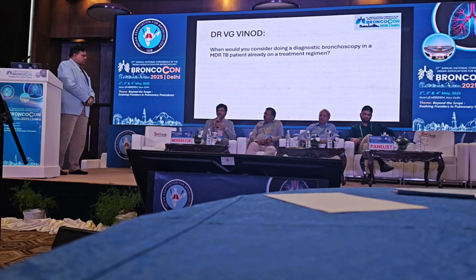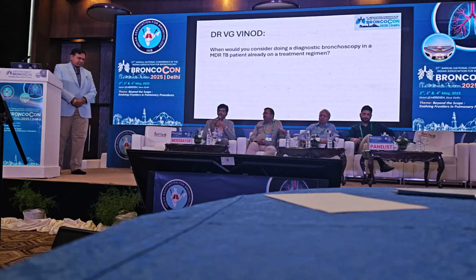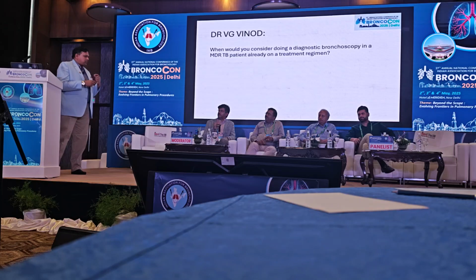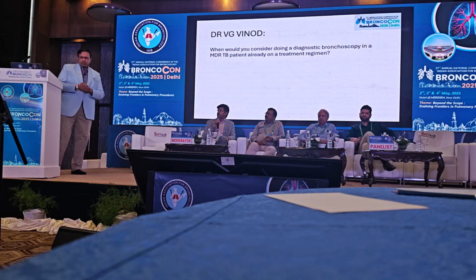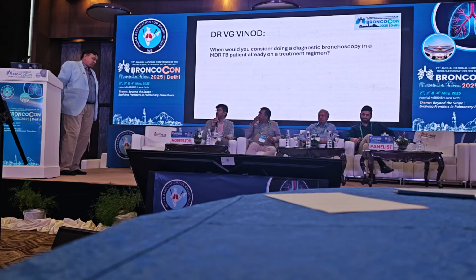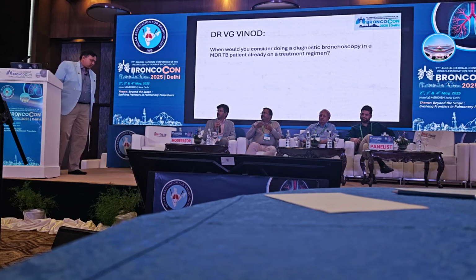A very odd consideration is not in MDR TB, but in many patients with drug sensitive TB. I had encountered at least 3-4 patients of ABPA along with TB, where we wanted to introduce steroids. Co-infection, coexisting diseases. The patient is on treatment and there is worsening of symptoms or X-rays, and sputum is not available. That also we can think of doing a scope. And if you are contemplating surgeries, surgeons may ask for a scope. Definitely, they will want to know that things are clear.